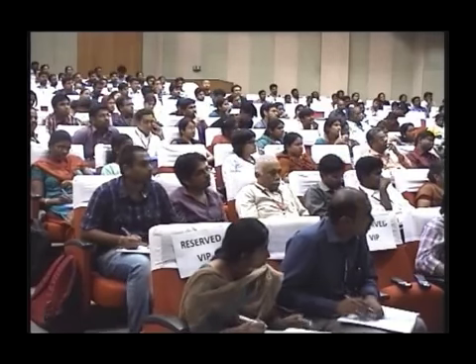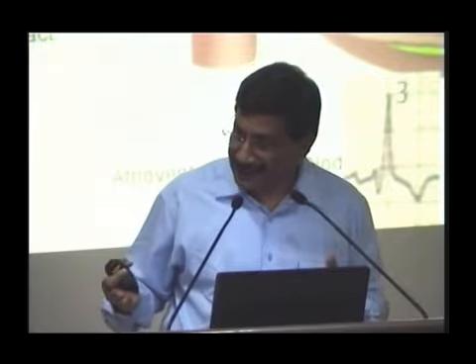Here the depolarization is delayed or normal? In right bundle branch block, depolarization is delayed or normal? Delayed. So what will happen to your STT changes? Just like it happened in ventricular hypertrophy. In ventricular hypertrophy it was delayed because the muscle was bigger. Here it is getting delayed because the bundle is blocked. So anyway, the depolarization is delayed.